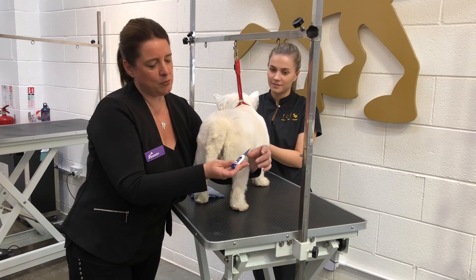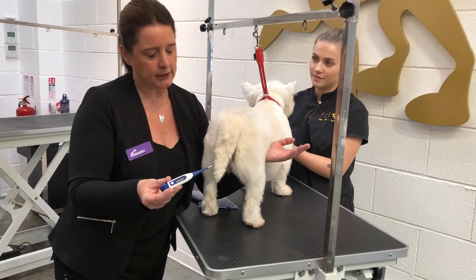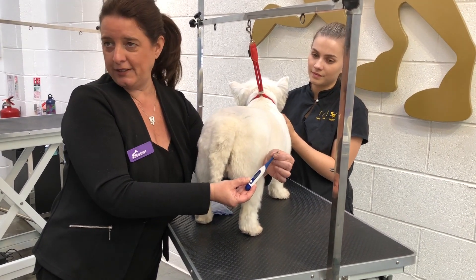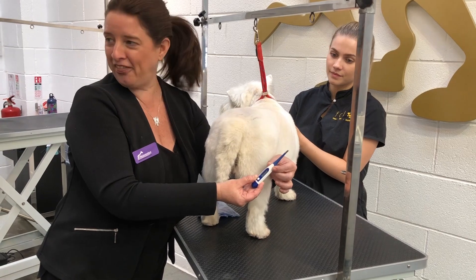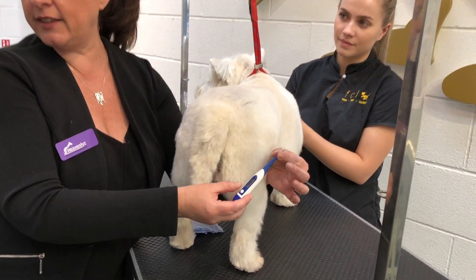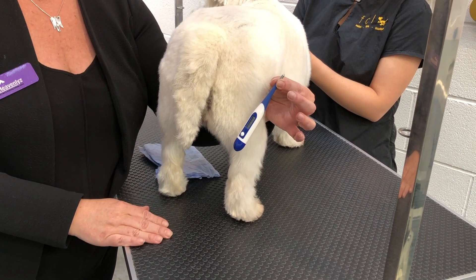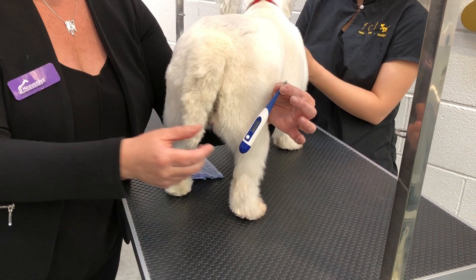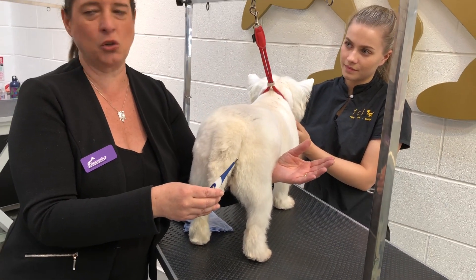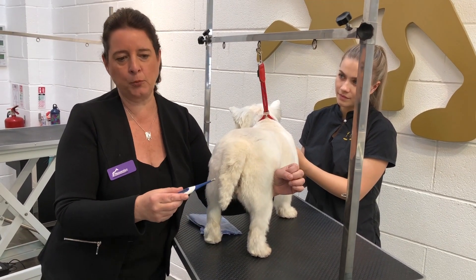When you use this thermometer, you just turn it on, it will beep and zoom to 37 degrees, and all you're doing is literally going to insert just the tip into the dog's bottom — not the whole thing, just that tiny tip. Most dogs tolerate it particularly well if you don't hold on to the tail whilst you're doing it, so they're not aware that you're doing it. You don't necessarily have to lubricate it unless you've got a tiny chihuahua or something like that.